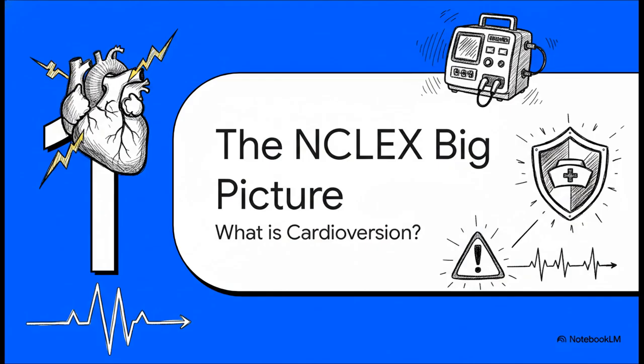Why does the NCLEX test this so heavily? It's simple, because getting it wrong has immediate, life-threatening consequences. Cardioversion is all about hitting the reset button on the heart to restore a safe rhythm, and your job as the nurse is to make sure that reset is done safely.